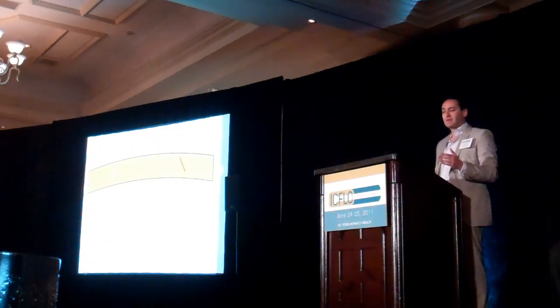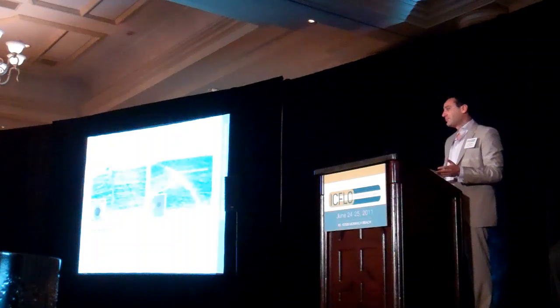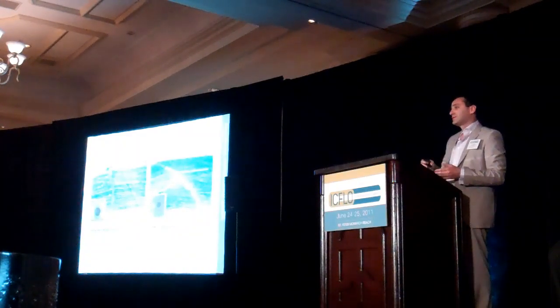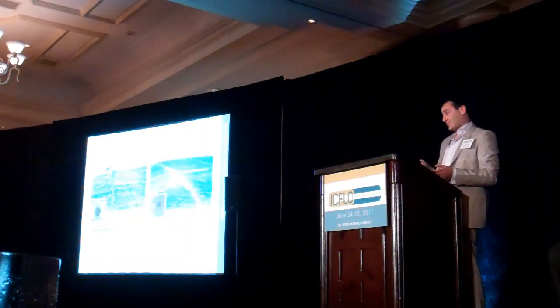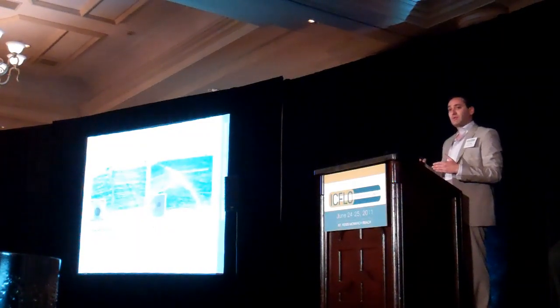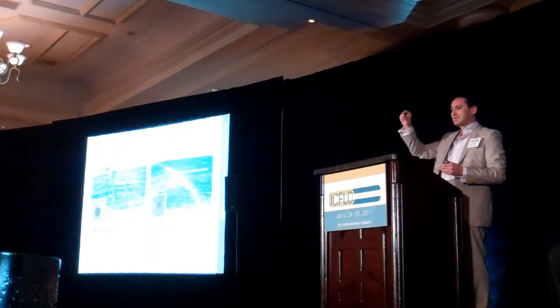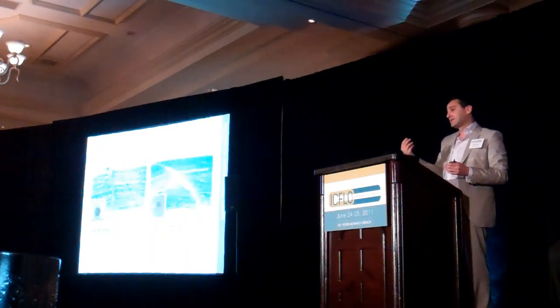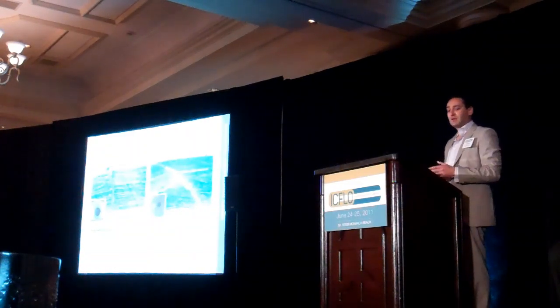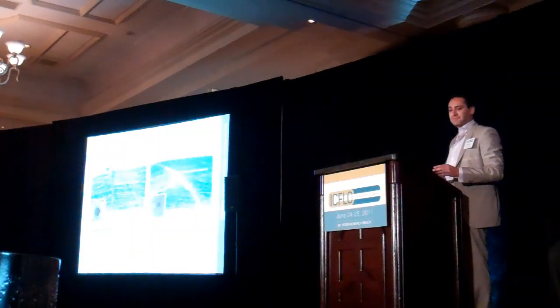And so this is starting to come out, and Zaldivar and Huang and Buddy Culbertson all have talked about this. The reality is, if we change these angle positions, do we have an impact? Do we have the ability to avoid wound gape? So if we make an incision on a steep axis that's pointed outward versus inward, do we inhibit wound gape? Do we inhibit the ability of epithelial plugs to form? If you see old AK incisions that are splayed open and it looks almost like sausage links of epithelium that are in these incisions, do we take the ability of that out by doing this? And then do we also impact collagen remodeling when we have a straight incision versus an angled incision?